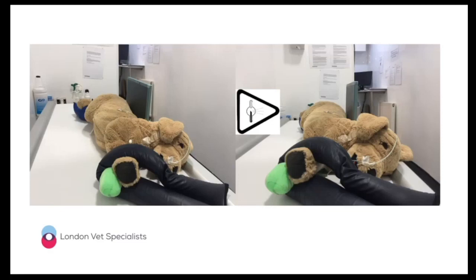It looks a little bit like this. This patient is in left lateral recumbency, and we have the tube just adjacent to the ventral aspect of the patient, and then the cassette positioned next to the patient, opposite the tube, on the dorsal aspect of the patient, and then we've got the primary beam passing from ventral to dorsal. So effectively, this is a VD view acquired using a horizontal beam technique with the patient in left lateral recumbency.